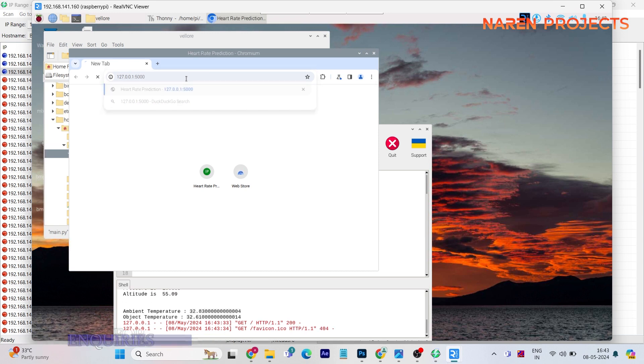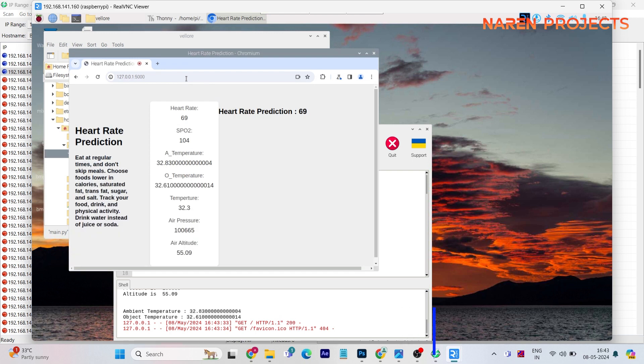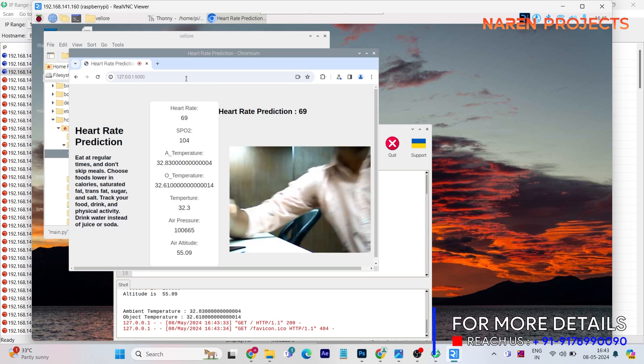Now a patient is sitting in front of the camera, so our entire application will automatically detect the heart rate.